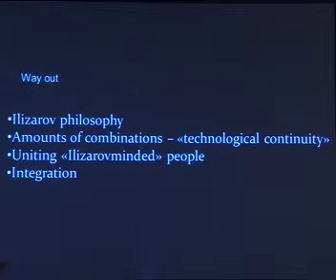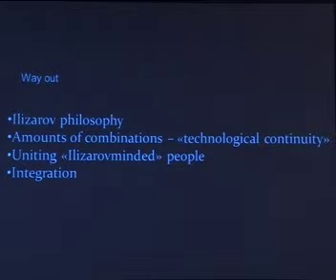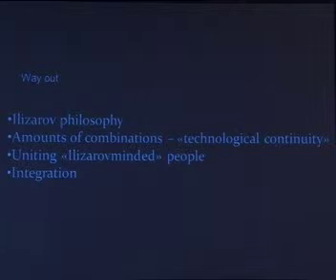So what is the way out in this very hard economic world? Of course, all of us must base on Ilizarov philosophy, not only on frames, but philosophy will help us to improve. We can use a number of combinations, but if you have Ilizarov as a base, it's quite simple. So we call this technological continuity, because in our center's concept, technological continuity is a very important thing. So we must unite Ilizarov-minded people.